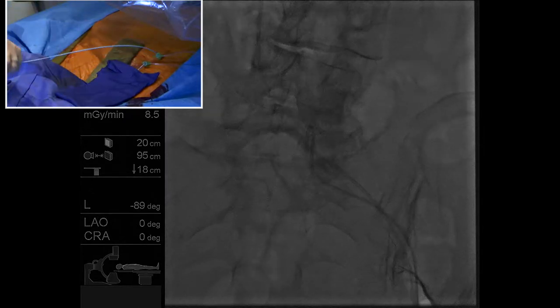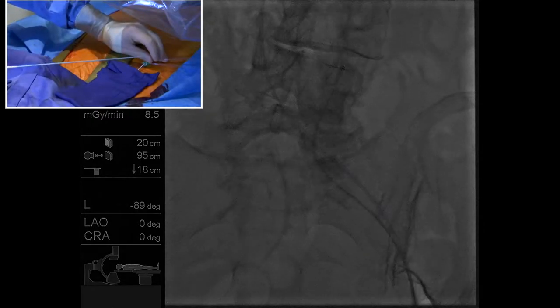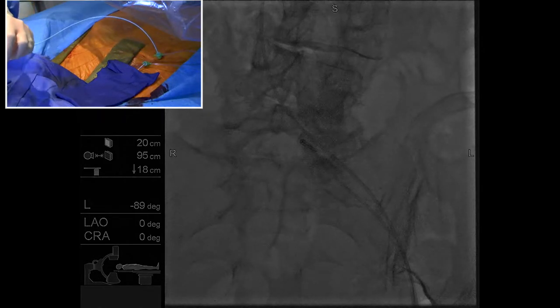We might have to do it from up here. Is this a stiff angle glide? Feels like it is. Can we get a regular angle glide? That's what we usually use. Not sure why it's a stiff one. Too stiff, guys. All right, so this wire's a bit stiff. So let's get the easier one. Take this out.